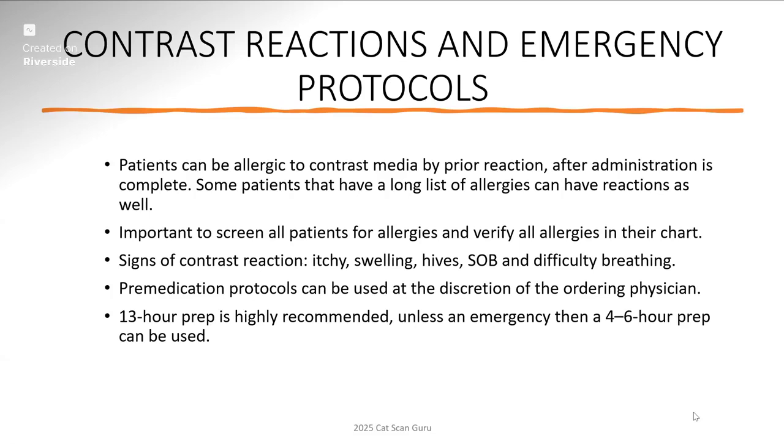So it's important to screen all patients for allergies and make sure you verify all their allergies in their chart, and even talk to the patients about allergies, because sometimes they'll tell you allergies that aren't in the chart. So make sure you communicate with your patients if you're able to, or with family, or just verify from the chart if they're intubated.